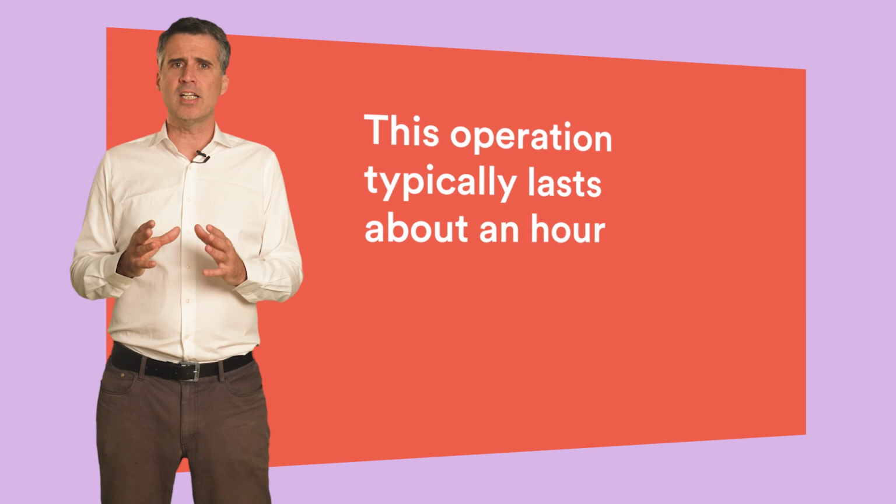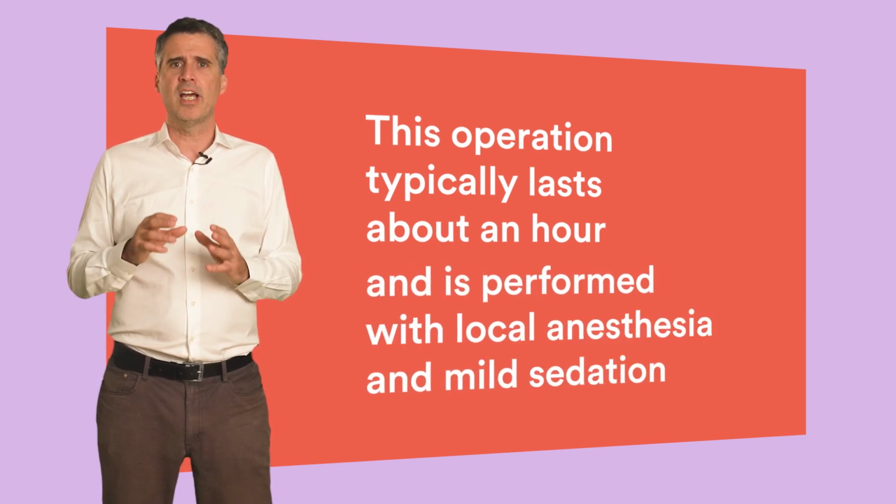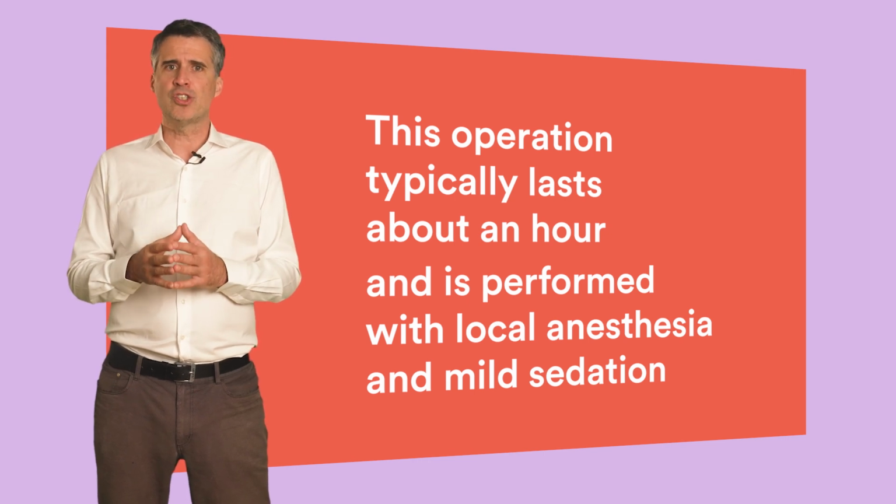Cerebral arteriography, like any procedure, carries its risks, although minimal. However, if this procedure has been proposed to you, it is because it is considered safer in your case to undergo the intervention than to leave the artery as it is. This operation typically lasts about an hour and it's performed with local anesthesia and mild sedation, although in some cases, deeper sedation may be necessary.